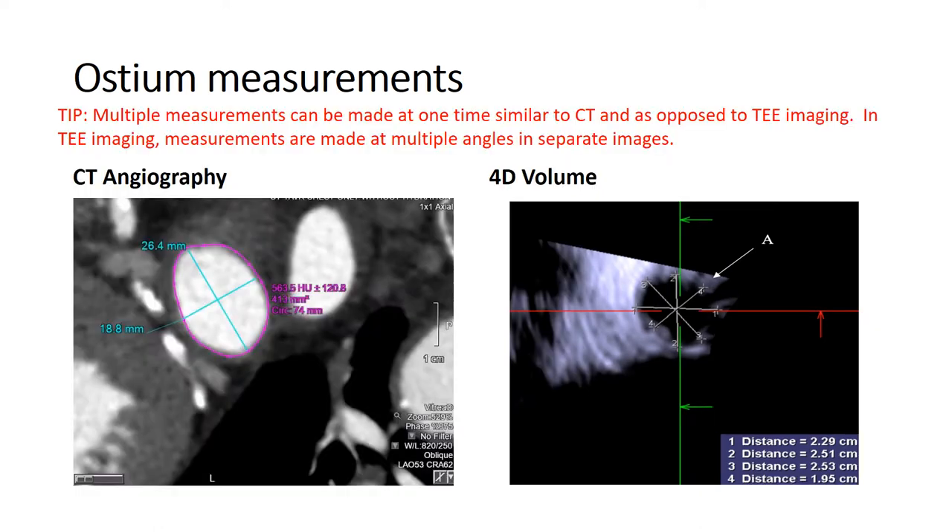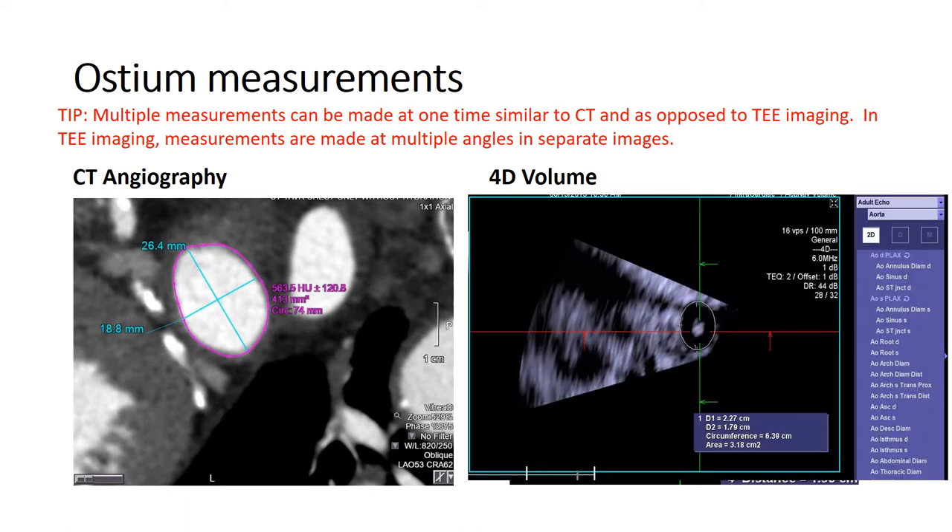This is a good example of ostium measurements. To the left, you have a CT angiographic still frame measuring the ostium of the left atrial appendage, and to the right, a 4D volume ICE image that resembles the CT scan — very useful for precisely measuring the device needed for the procedure. You can also obtain circumferential measurements and an area-derived diameter from 4D volume ICE as you would with CT scan. These are optional measurements but provide additional information to help decide on device size.